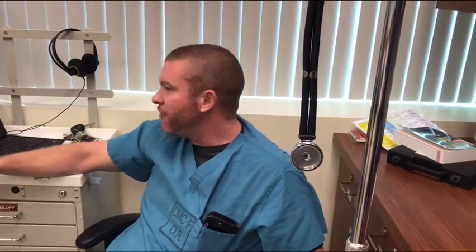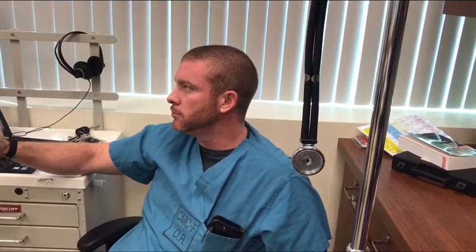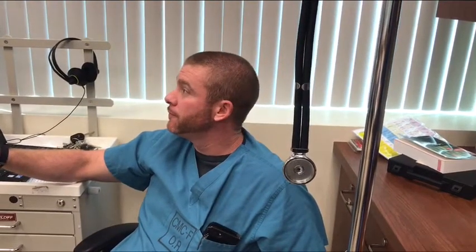If we're still 20 minutes out, I'm going to help blow off the gas, because we can build up CO2 really quickly. How do we build up CO2? By not breathing, by having a low respiratory rate, low minute ventilation. So we'll decrease our rate and our volumes once we have blown off the gas. We'll say we're blowing off gas for 10, 15 minutes, or as they're closing up. We said about 20 minutes. So you're properly doing that. We know that we're going to get CO2 back when we lower the rate and the volumes. It'll take about 2 minutes probably.